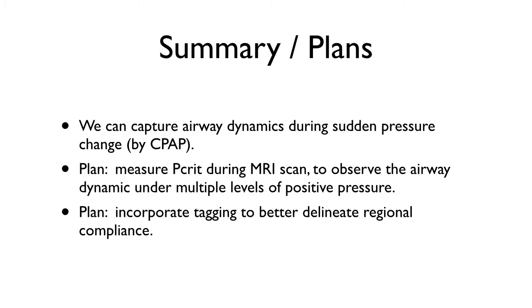Another plan I didn't talk about yet is that we want to incorporate tagging, spatial tagging, to better delineate regional compliance. So by that, I mean we're going to apply spatial grid tagging. Spatial tagging is the technique as it's known in the MR community, and then we're going to watch those tag lines deform as there's an airway change.